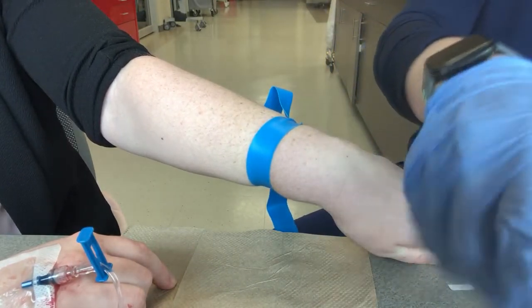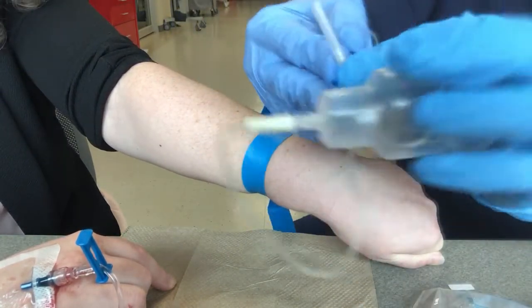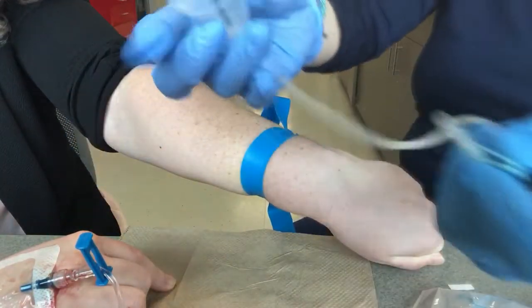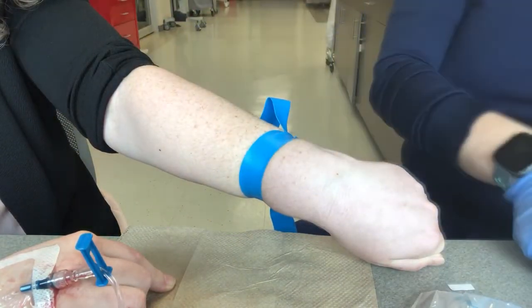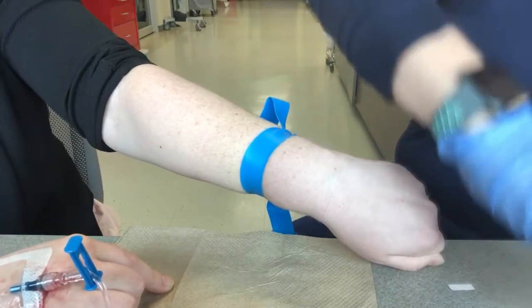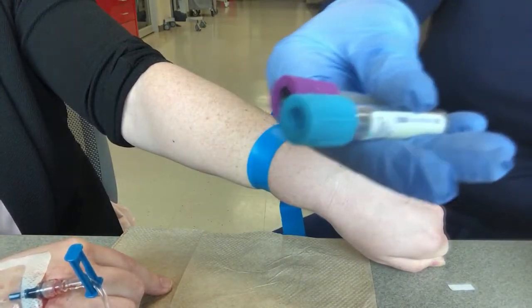Thankfully this is already ready. We've got our needle — it's going to have the same kind of bevel situation. I'll usually grab it like this. The vacutainer is already attached; the tip of the blood tubing will go right there. My alcohol is now dry. I've got my two tubes — a blue and a lavender. We can talk about what those would be used for later.